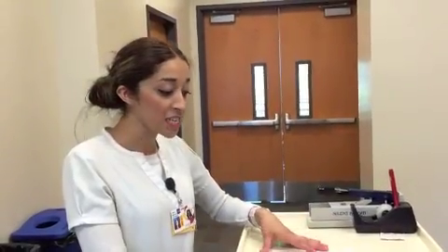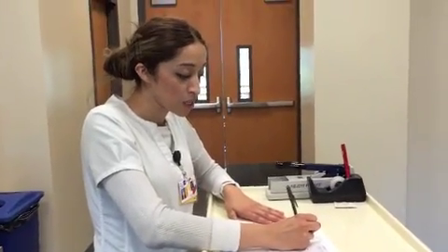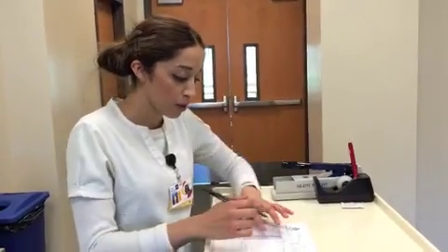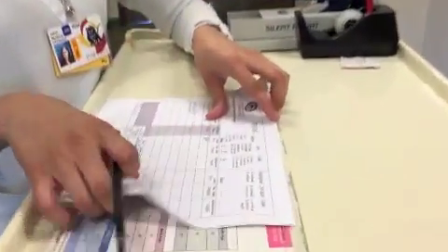So last thing you want to do is come to your MAR once again and put the site that you administered your injection in. There are codes on the top of the MAR, and you will just select which one you did.